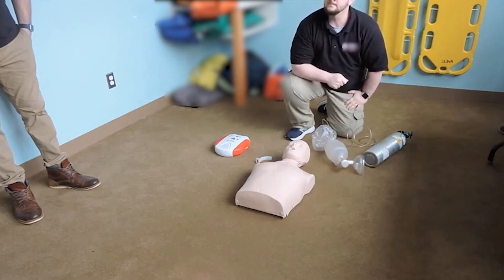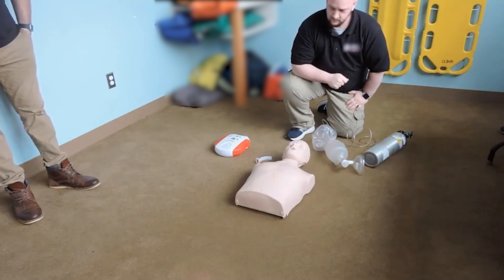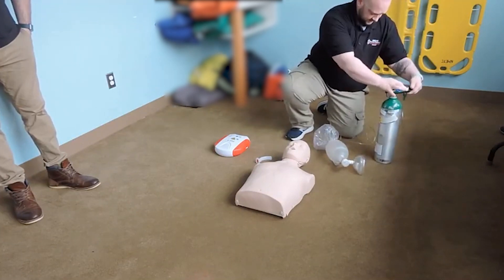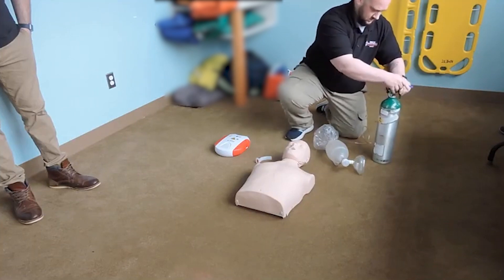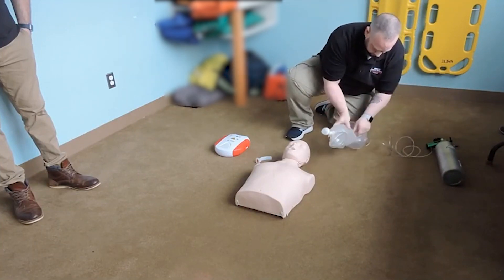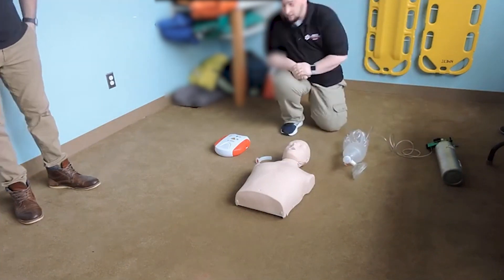If you feel that your equipment is ready for use, you can shut it down — we'll assume it's on for the rest of the scenario. Understood. I'm going to shut off my tank. And we're on scene with your patient.